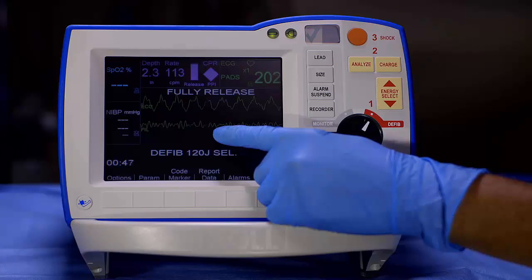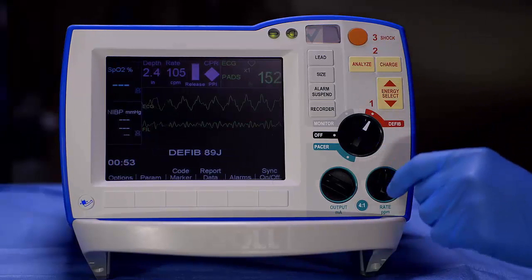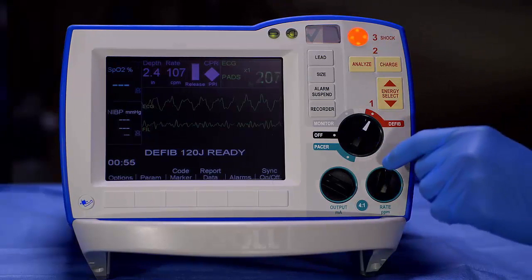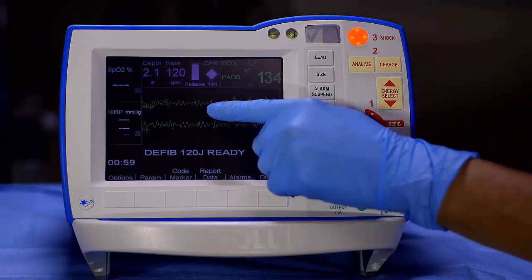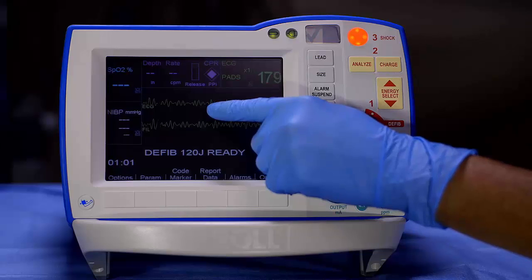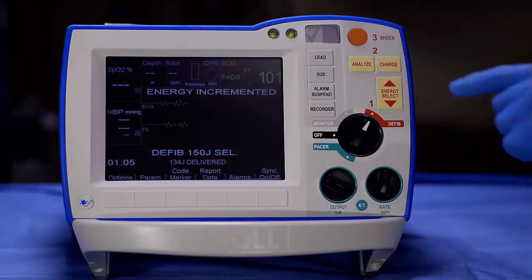CPR compressions should be paused when assessing the ECG for a shock or no shock decision. If an apparent ventricular fibrillation rhythm is seen while using see-through CPR, ALS providers should charge the device while continuing compressions. Once the device is fully charged, pause compressions and confirm ventricular fibrillation in the unfiltered ECG waveform, then press SHOCK.